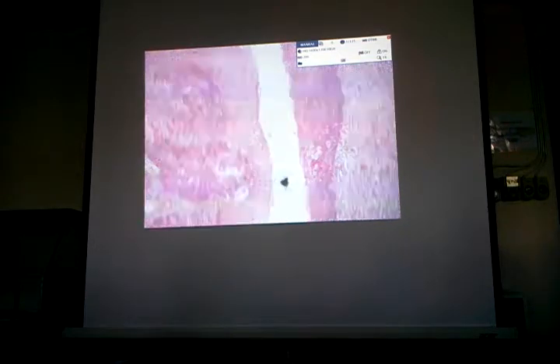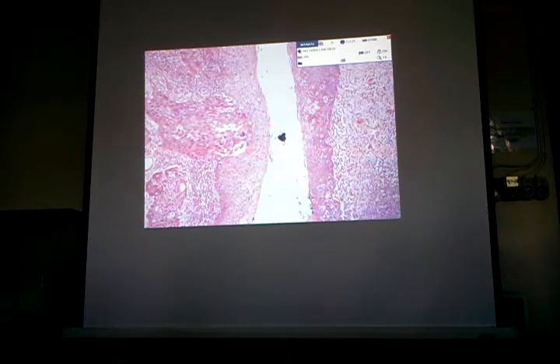This is the portion which shows us the malignant squamous cells. Compare now the characteristics of the nuclei in the malignant portion with the nuclei in the benign portion. So there is no maturation pattern here at all layers of this sheet of squamous cells. All cells are displaying large and hyperchromatic nuclei.